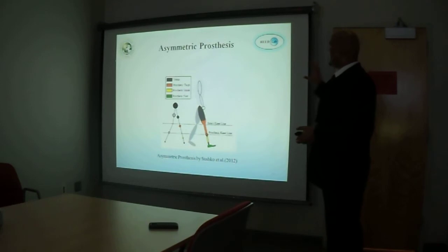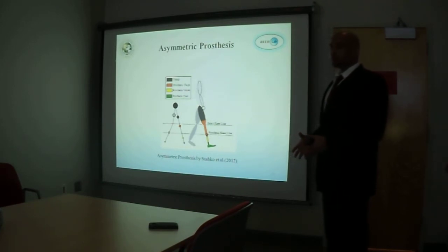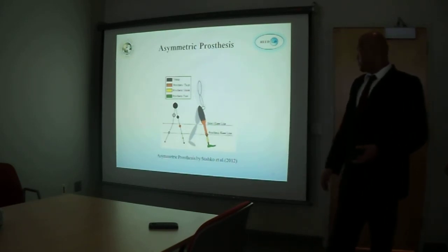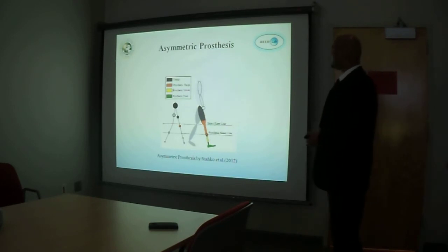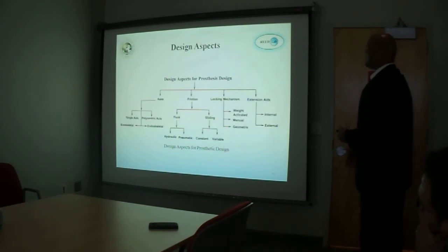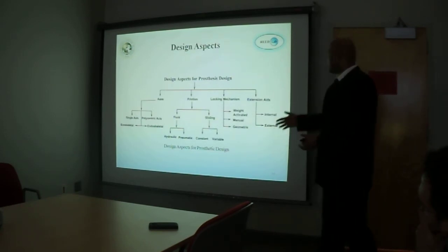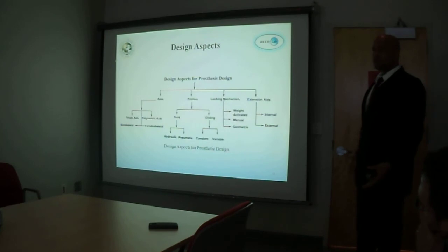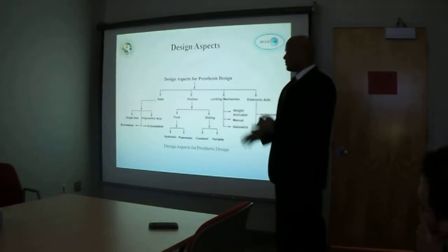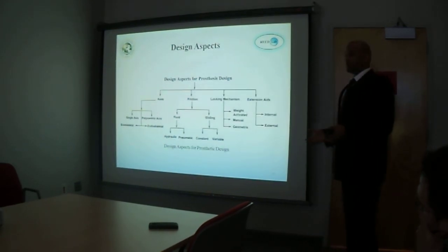And this is the concept, the diagram that pretty much puts it all in perspective, showing how the prosthetic knee can be shifted from its anatomical position, by Sushkov et al. So, the design. When designing a prosthesis, there are a lot of aspects to be considered. And in my design, I specifically chose a single-axis system, so it rotates. It also has a translational component.